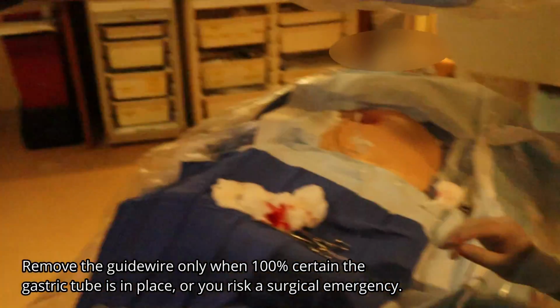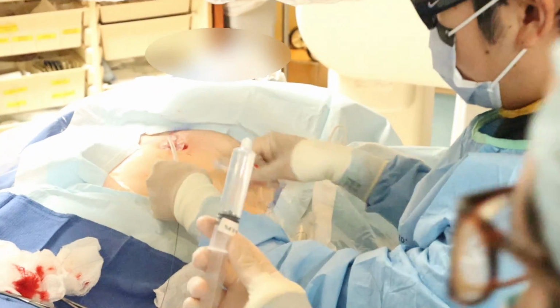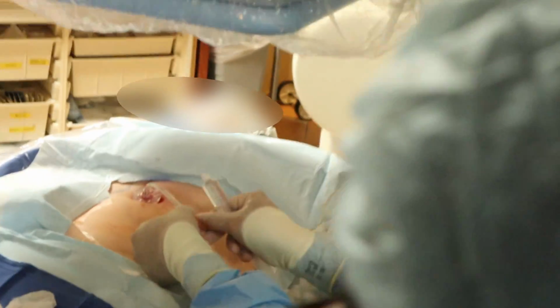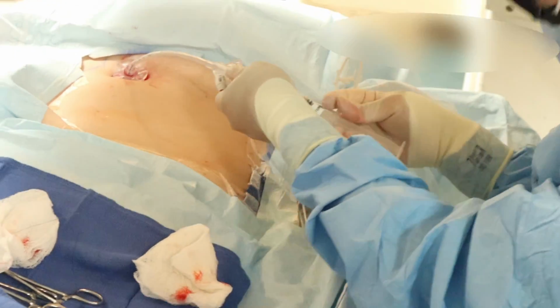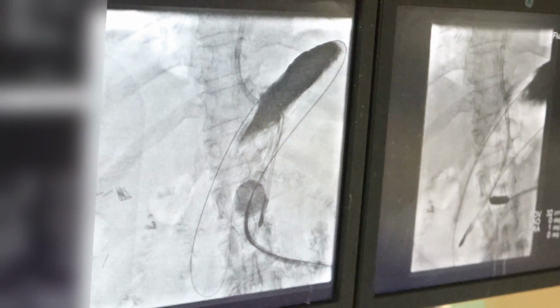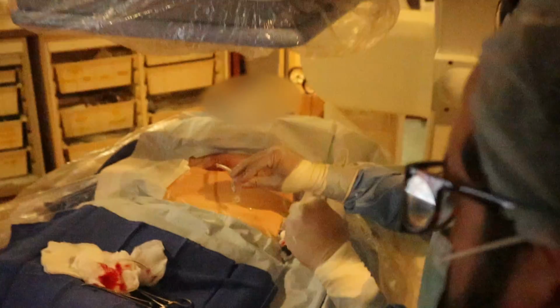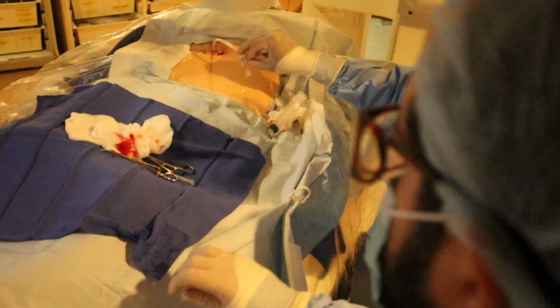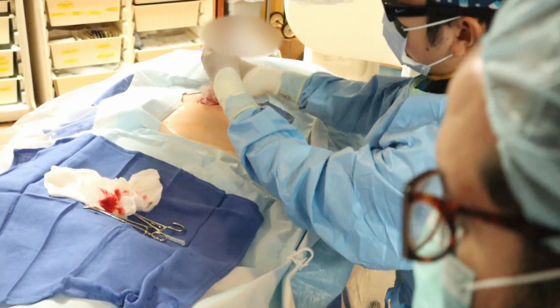It looks like we're in the stomach, right? We're going to inject some contrast to the G-port. So it looks like we're in between the 3 T-tacks. We'll see. And finally get rid of the wire here. Alright. Get rid of the wire. Nice and easy. Cinch it up.